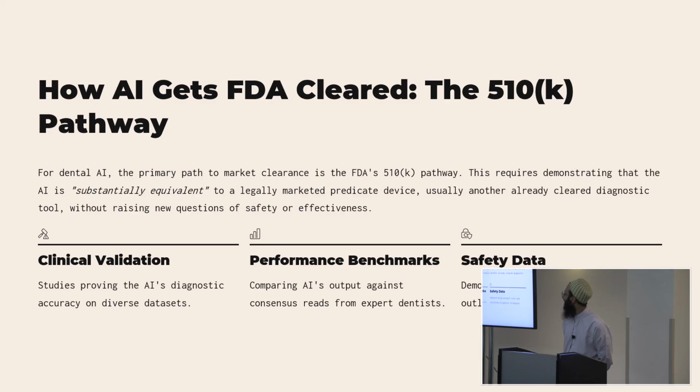Okay, any more? I'll go into kind of how the FDA trial was set up too right now. So effectively, the FDA trial looks to do three things. Validate that the AI can actually find whatever lesion. So you have to run a clinical trial for each type of pathology that you say you want to detect. So for caries, you run one clinical trial.